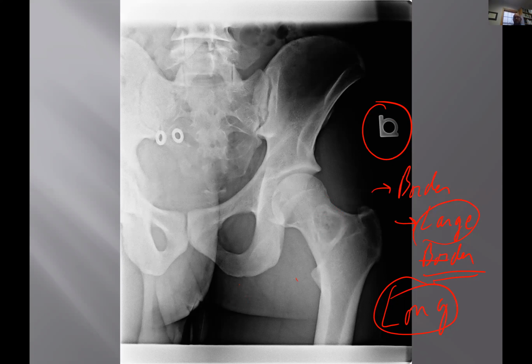And guys, if you can't leave this lesion alone, then send it off to a radiologist, transfer the legal guilt, the legal burden, to someone else's report, or at least share the burden. And don't let these pathologists get their hands on this person. I don't want them to mess it up. Fibrous dysplasia has so many different cell types that they biopsy it sometimes and call it something that I don't like, and it really ticks me off. You can tell, I'm not happy about it. It's not good for the patients.